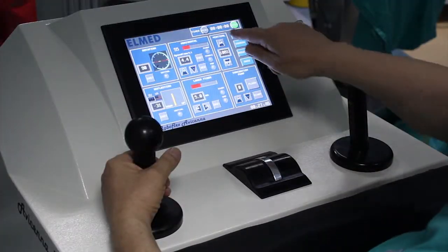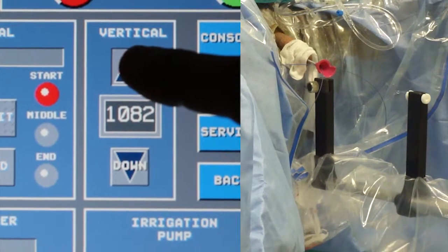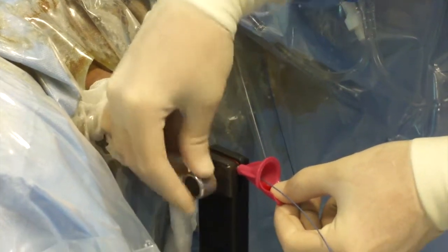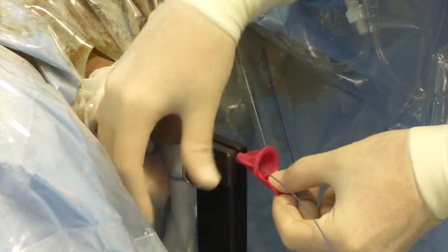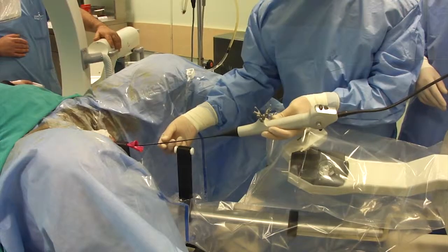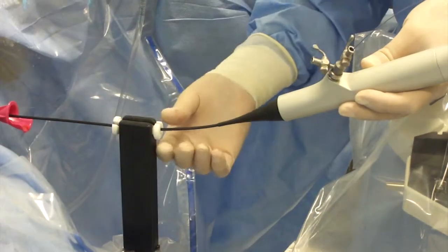The height of the arm can be adjusted according to the patient's anatomy using the touchscreen at the console. The access sheath is fixed by the distal stabilizer. The flexible ureteroscope is introduced into the sheath manually, supported by the proximal stabilizer.